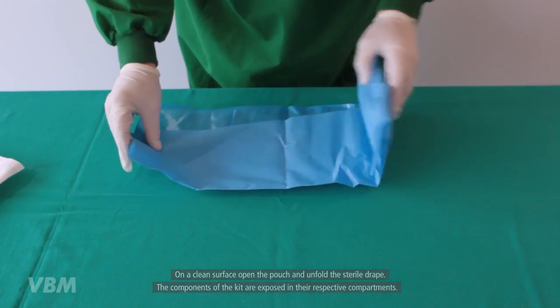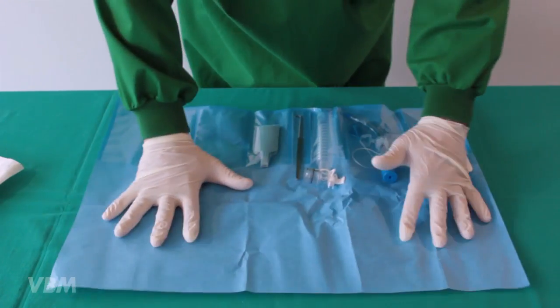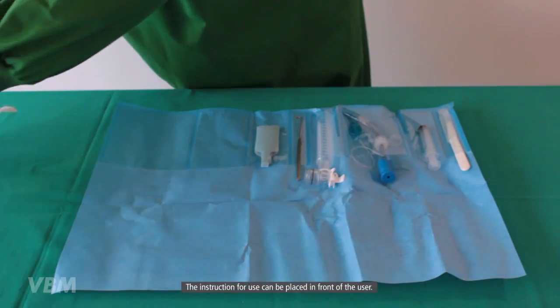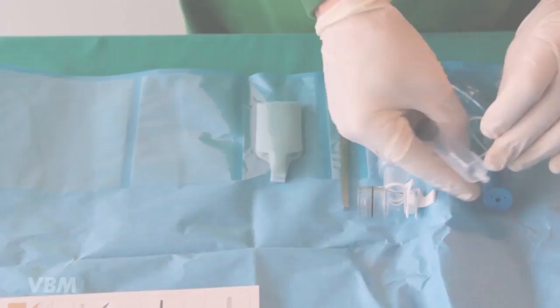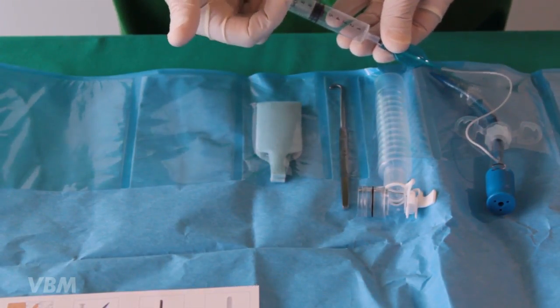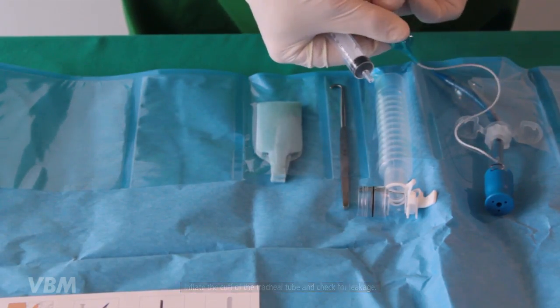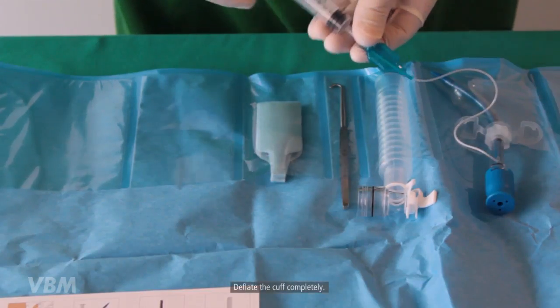The components are arranged in their respective compartments and the instructions for use can be placed in front of the user. A functional check should be carried out prior to use: inflate the cuff of the tracheal tube and check for leakage, then deflate the cuff completely.